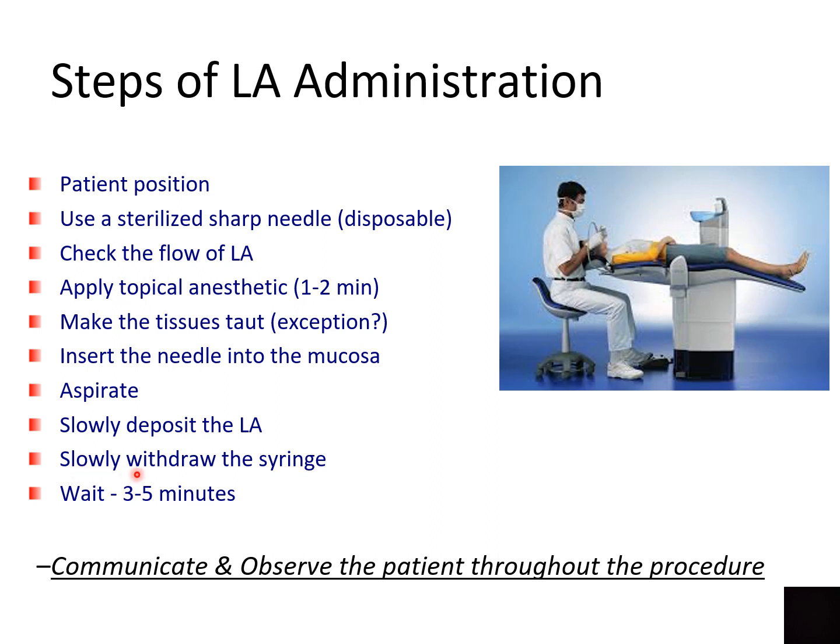And then you withdraw the syringe slowly, and then very importantly, let the local anesthetic work. If you were to start your treatment straight away, obviously patients would start feeling a bit tingly straight away. Most patients would, but that doesn't warrant treatment straight away. Wait for a good 3 to 5 minutes so that the LA is fully effective.